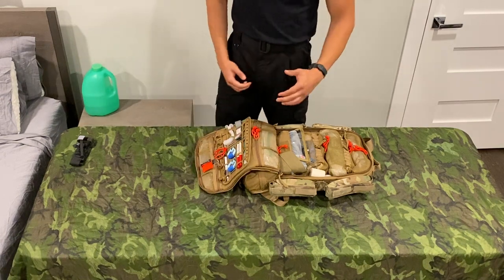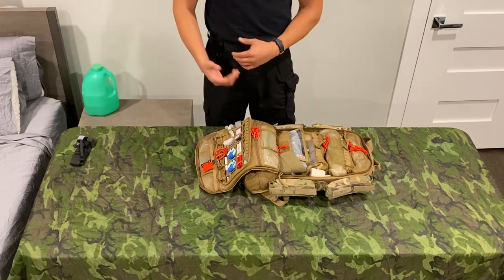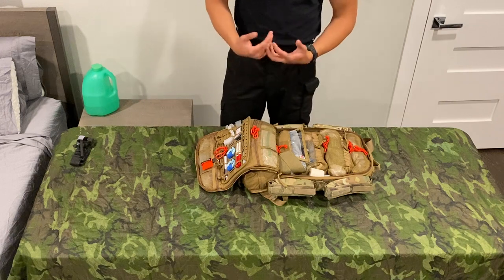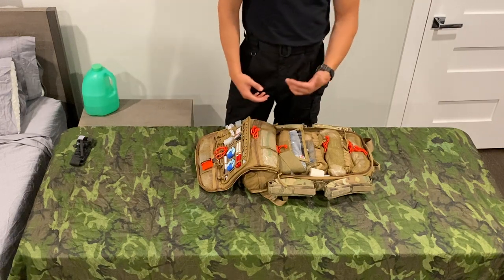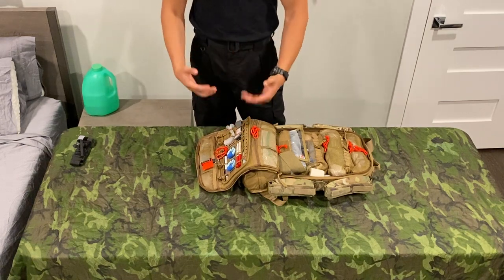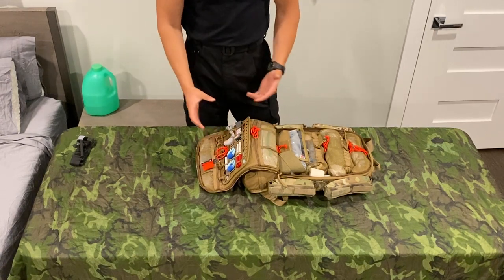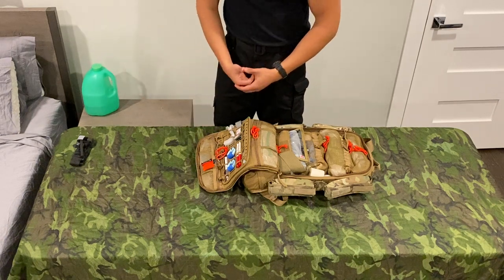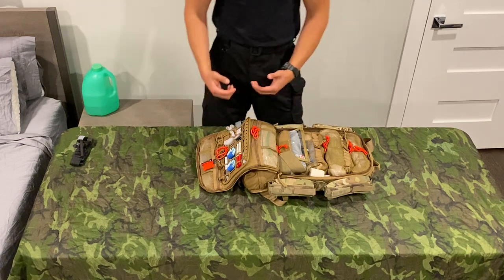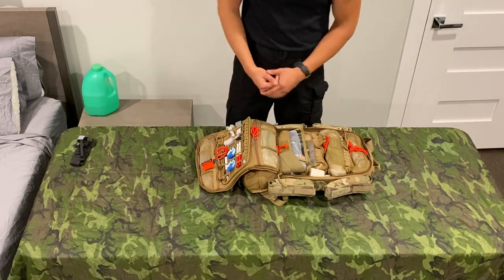OPAs — I'm not a big OPA fan. I've run codes at work with just an NPA before. The issue with OPAs is they're indicated in somebody who's unconscious with no gag reflex, but when somebody starts coming around and regaining the gag reflex, they'll bite the OPA — and the OPA is brittle plastic, it breaks, and then you end up with an airway obstruction. That's why I'm not a big OPA guy. It's a size four OPA which fits most of the guys on my team. The issue of them breaking can be solved by having the silicone one — maybe I'll move to that in the future.